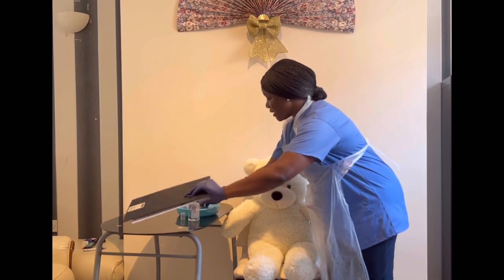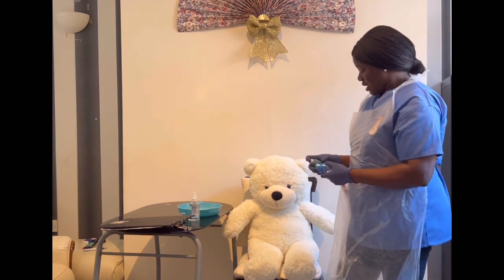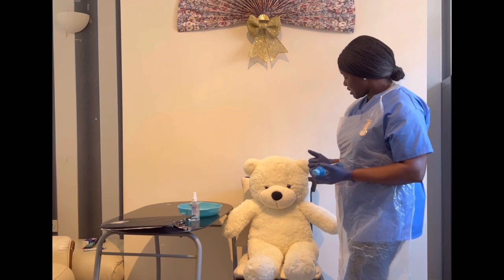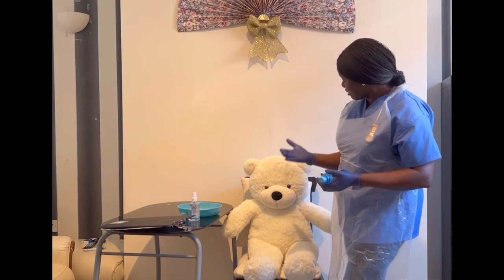So Harry, before I go ahead, I'll just quickly explain what we need to do. Is that all right? Yes, nurse. Okay, Harry, I need you to sit upright, with your chin slightly tilted. I need you to exhale completely.